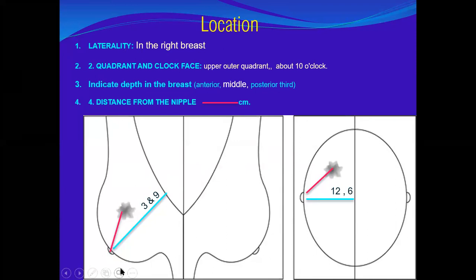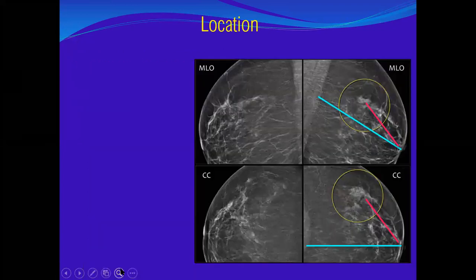These are just to show the locations of the lesions. Describe the locations. Okay, describe for me this one. Another, you or another one? Another. No problem, I can proceed. This is the left breast. This is also in the upper outer quadrant, either 1 o'clock or 2 o'clock on the left side.